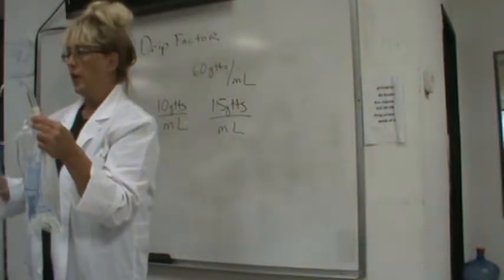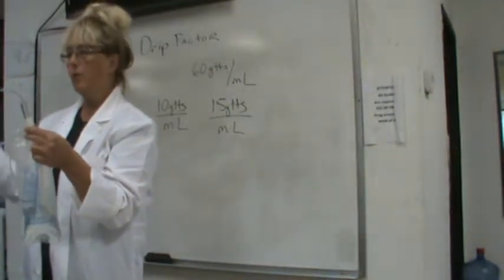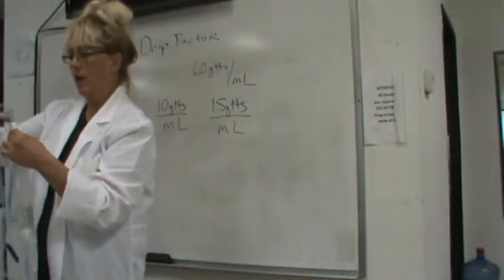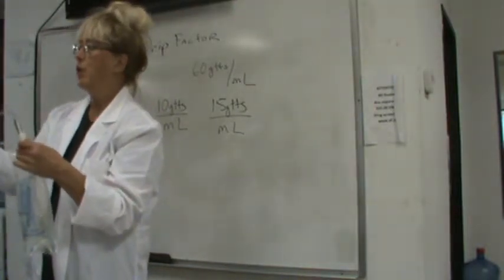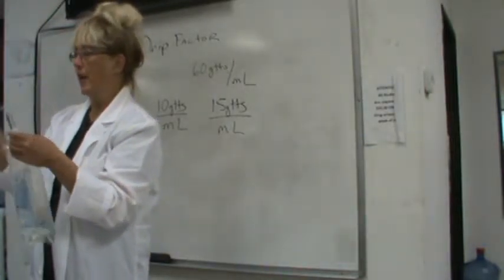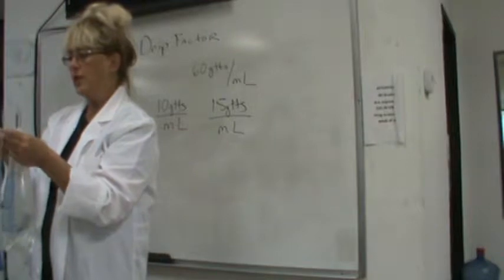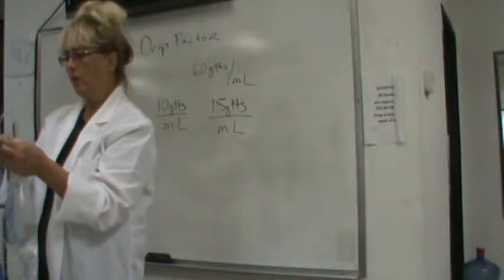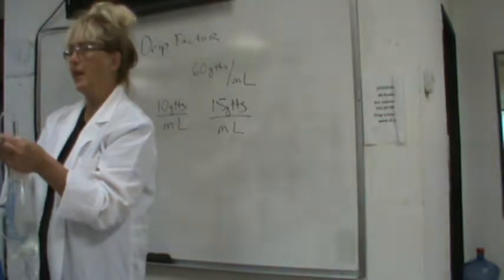I'm going to show you a trick, and it's always going to work. Now here's what we're going to do next. Don't close this. Grab this piece at the bottom. Make sure the cap is on. There's a cap at the bottom. It should be on, right? Yes. I want you just to gently loosen it, just a little bit. Keep it on though. Just loosen it just ever so slightly.